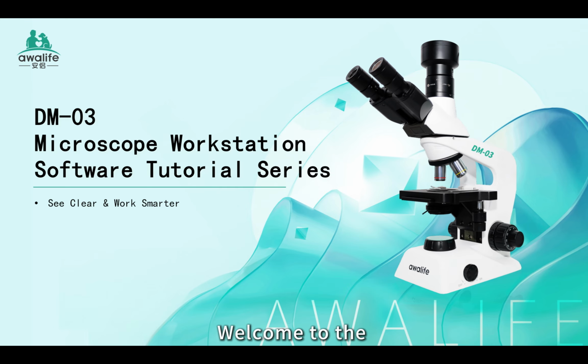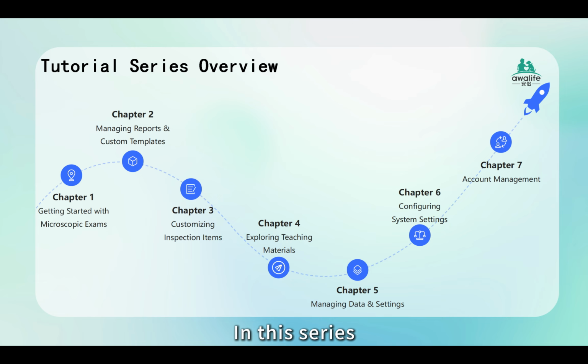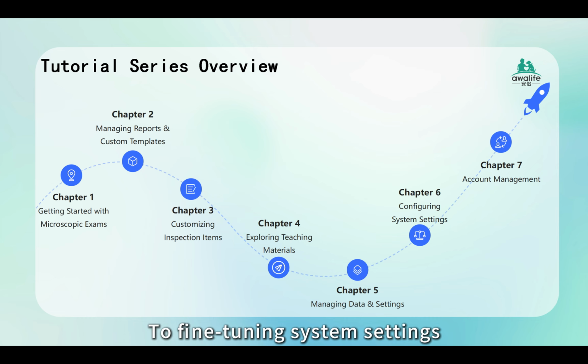Hi there, welcome to the DM-03 Microscope Workstation Software Tutorial Series. In this series, there will be 7 chapters for you to master every feature of the DM-03, from starting a microscopic exam to fine-tuning system settings. Please feel free to jump to any chapter that suits your needs, and let's unlock the full power of your DM-03 together.